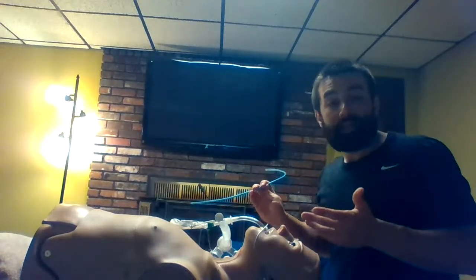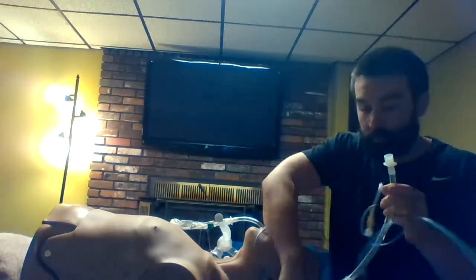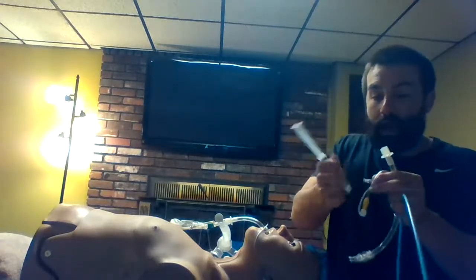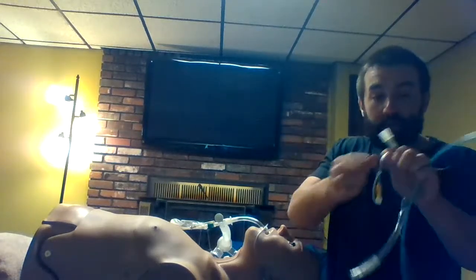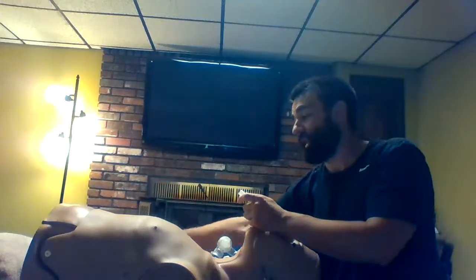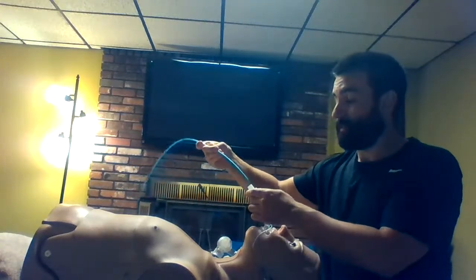So you would need a second set of hands here, obviously. We get another ET tube checked, lubed, ready to go. And you want to put a good amount of lubricant on this thing, all right? I'm going to go ahead, draw that syringe back, and leave it on there. Okay, I would have a partner holding this one. And what we do, when everybody's ready, and a lot of times we still will drug these patients and sedate and paralyze them, so we're not messing with a bunch of stuff.